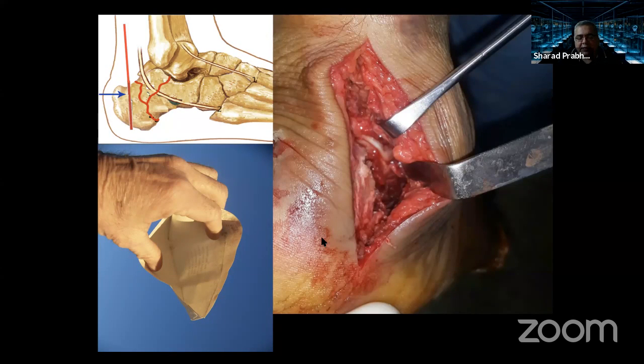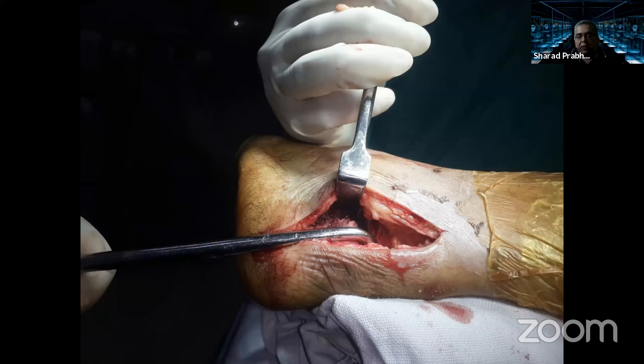So this started out as a single incision approach and evolved to a dual incision approach. When we were starting out initially, we would give only the longitudinal limb, and you are essentially lifting a flap without having any angles to that flap. The rest of the reduction usually proceeds in the same way.